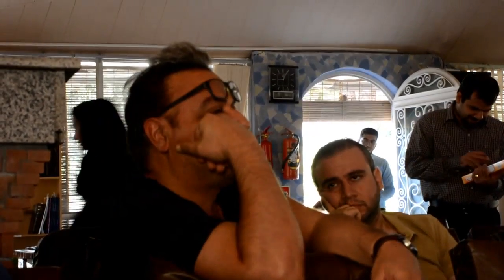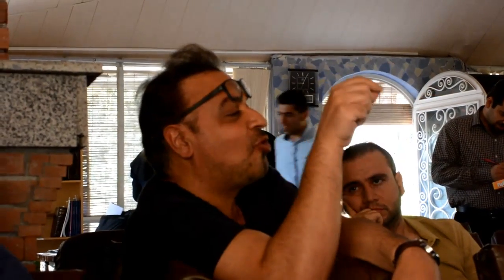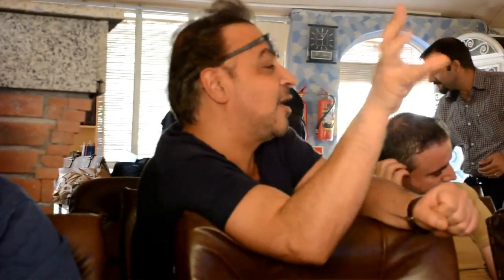At laparoscopic operation, there was a shrunken gallbladder and intrahepatic gallbladder. After a few dissections, I decided to convert to open surgery for two reasons. First, I saw the anatomy is not clearly defined, so it's very dangerous. And second, for learning, I wanted to see what I saw in the camera in the laparoscopic situation, and what I can see in open surgery.